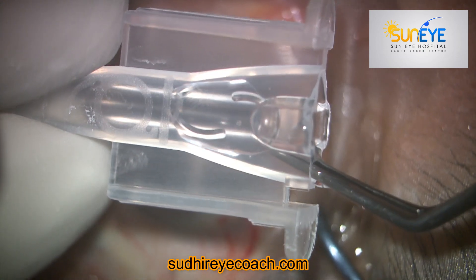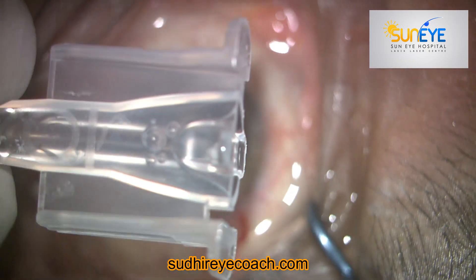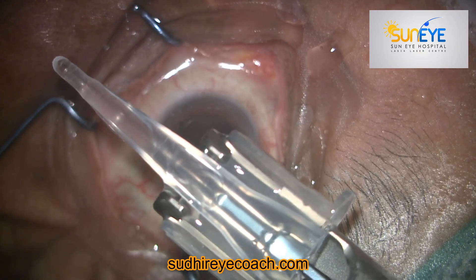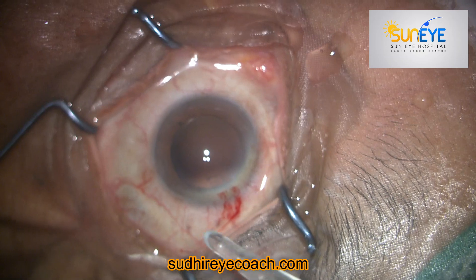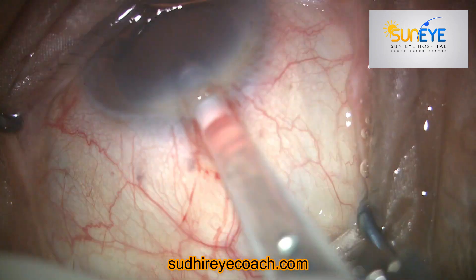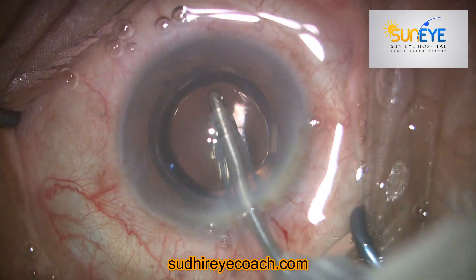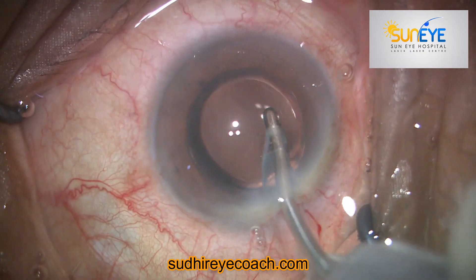Now this is the right way of loading — the IOL is going just like a baby folding its hands and legs. The IOL is now ready, and as you push it through the plunger it goes very easily through the cartridge and through the incision. Using the wound-assisted technique, you can very slowly and easily implant the lens inside the eye. It opens in a better way compared to the standard Tecnis. Thank you very much for watching.